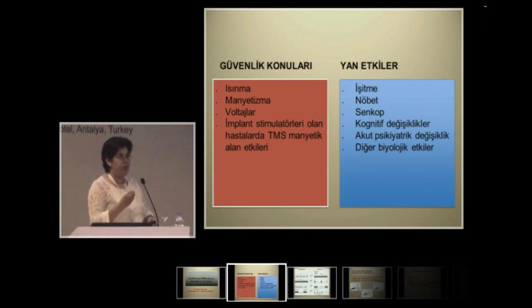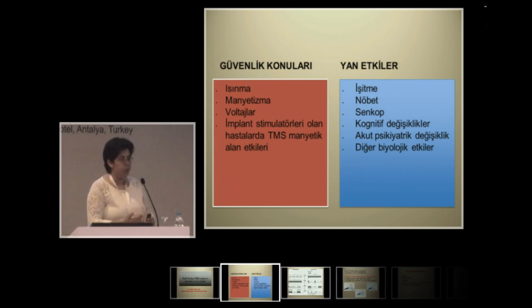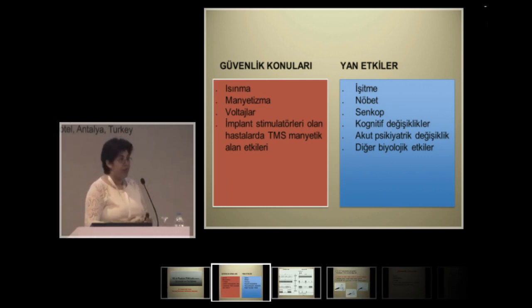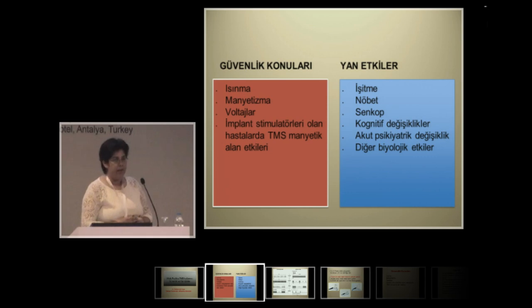These are the general subjects I will address in my presentation. First of all, I will talk about the safety concerns, such as heating up, magnetism, voltages, or if the patient has an implant or a stimulator in his brain, what will happen if you use TMS.